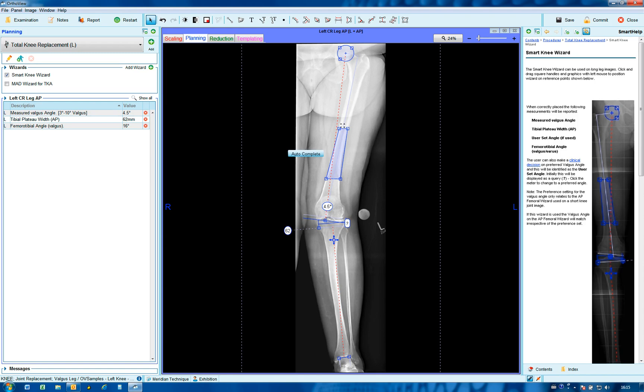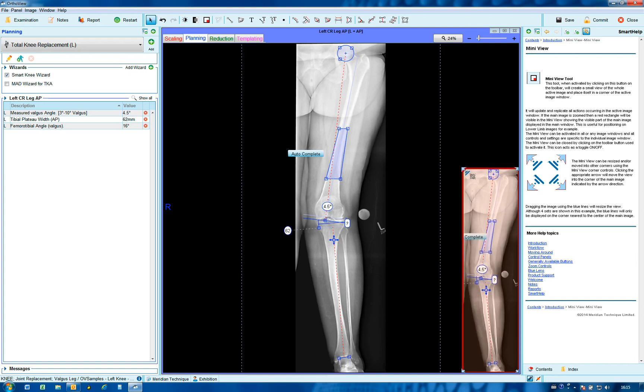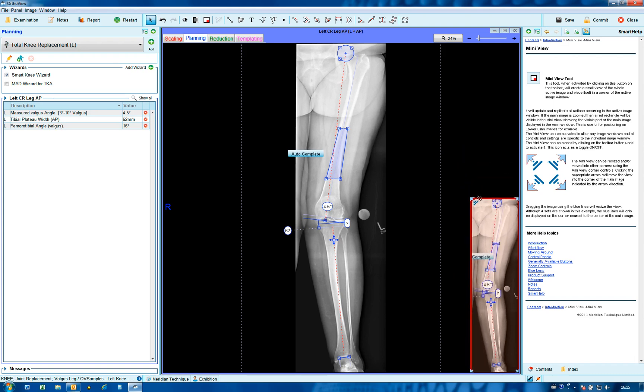When using a long leg image such as this one, this magnifying tool can be used to identify where you are on the image. Called mini view, it launches and shows the long leg in this screen. The size can be reduced as needed.